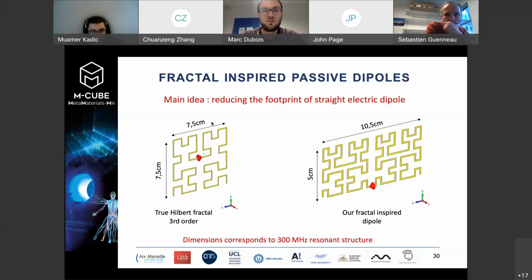So it's really hard to evaluate, especially because MRI can't map it. I've shown you all the B1 maps, which are maps of the magnetic field. Because the magnetic field has an impact on spins, we can image it, but the electric field has not. And so you're kind of blind. So what you need to do is simulation and experiment: you show that the B1 map you simulate and the one you measure are the same. And then you can say, okay, the electric field in my simulation is good. That's the only way, so that's a big challenge.